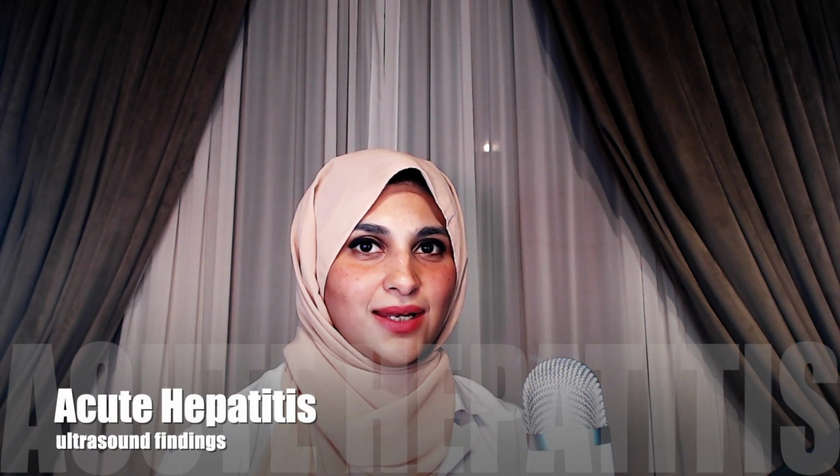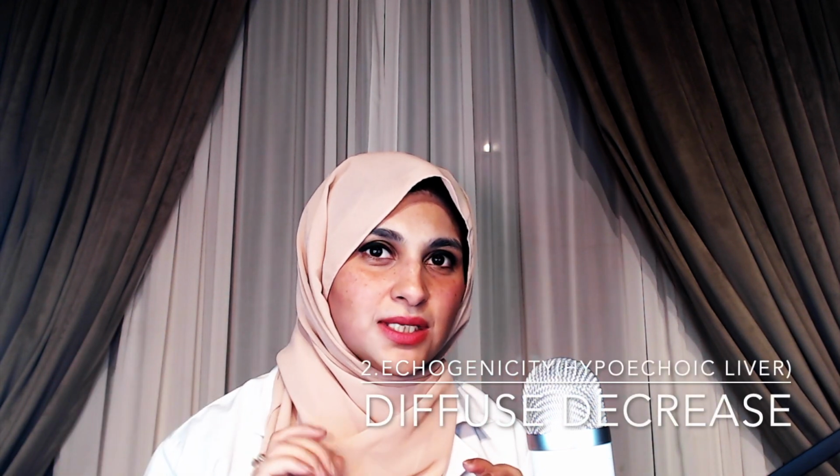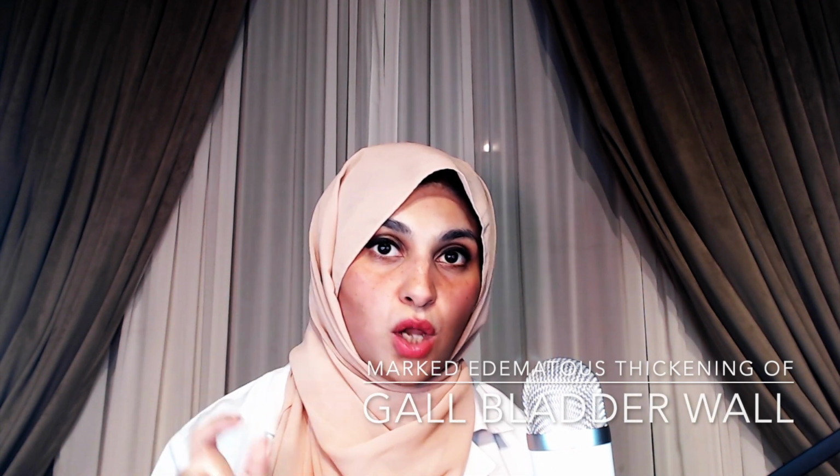The ultrasound findings of acute hepatitis. So let's talk with the same pattern. Number 1, taking the size of the liver, enlarged size of the liver. There will be increase in the size of the liver with acute hepatitis. Number 2, there will be diffuse decrease in the parenchymal echogenicity of the liver, that is a hypoechoic liver or a darker appearing liver. Number 3, increase in the echogenicity of the borders of the liver and the portal vein borders, giving the starry sky appearance. Number 4, there will be marked edematous thickening of the gallbladder wall.